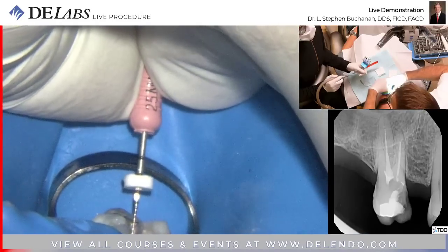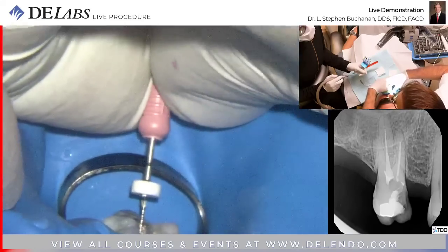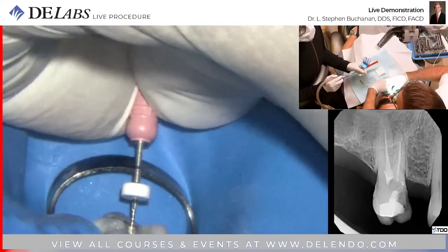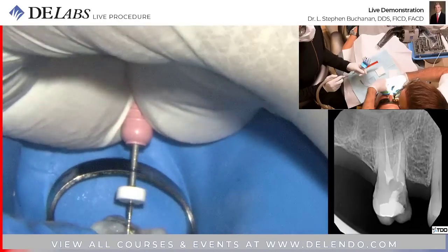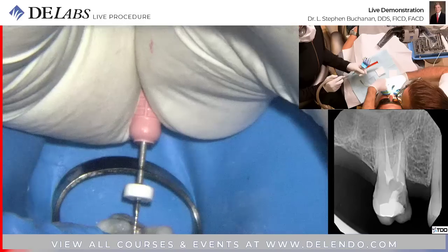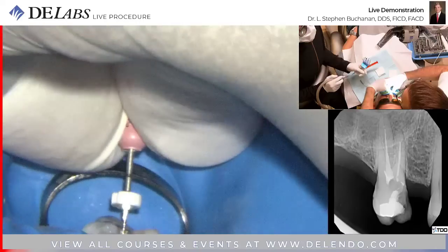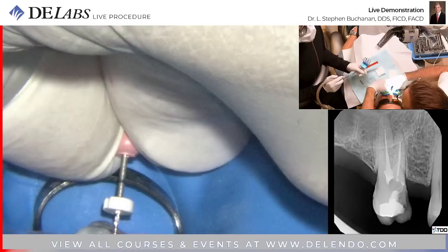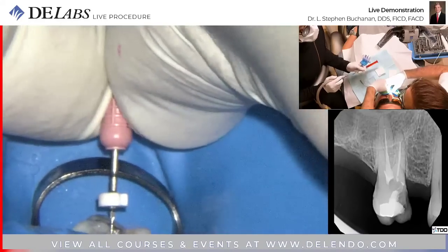Okay, still sighting on that spring bow because my stop is too far away from the tooth to get a decent reference from that. And if I watch wind this and it doesn't make any progress, it's time to take the thing out of there. But if you can cut and make a little bit of shape where this thing is tightly hanging up, that means your file is touching on its lateral sides, two opposite lateral sides.